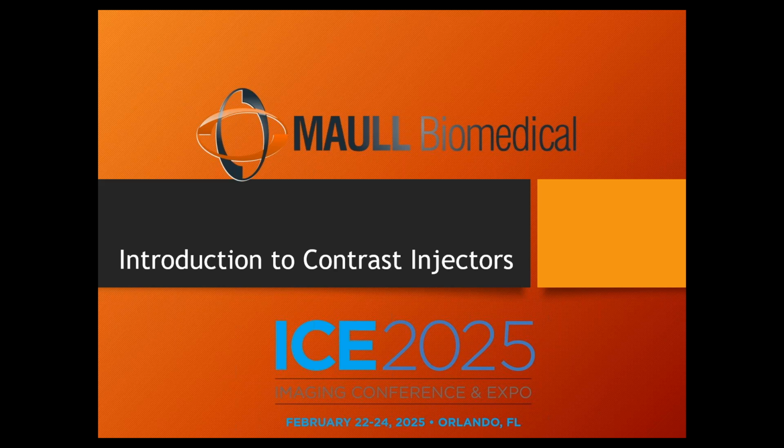Now, if we're going to do that, then we have to put something in the blood vessels that will make the blood vessel absorb radiation. And that is a specific kind of fluid. It's called contrast fluid, and that's the fluid that's in these syringes here. We're not really going to get into it, but due to its makeup, contrast absorbs X-rays, and it's really, really good at it. So if you put even a minuscule amount of contrast in a blood vessel, that blood vessel will now absorb the X-rays, and it will show up real nice and bright on the X-ray image. So that is the whole purpose of the contrast injectors. That's why they're called contrast injectors.